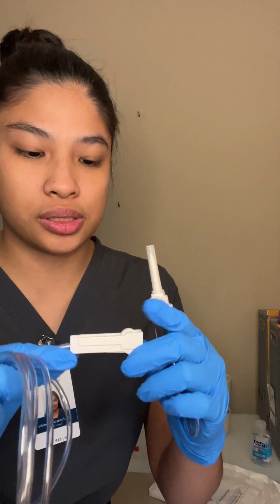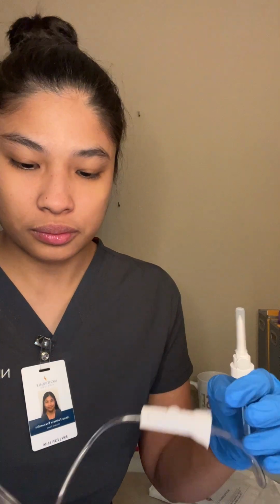This is the roller clamp. This is to regulate the drops, so you can either turn it on or turn it off. Like I said, this is what you'll use to regulate the rate.